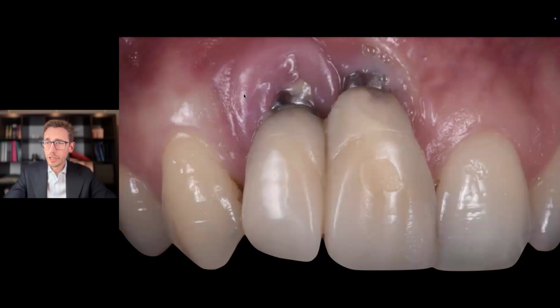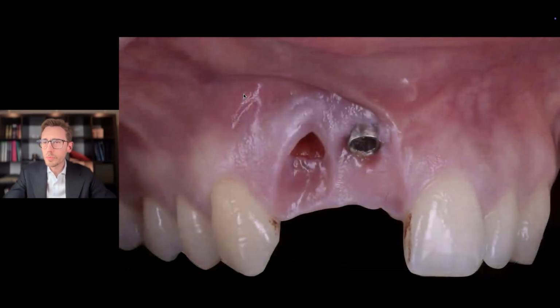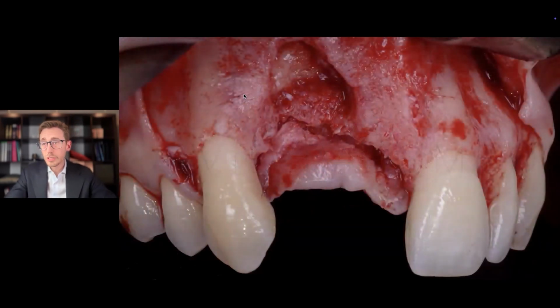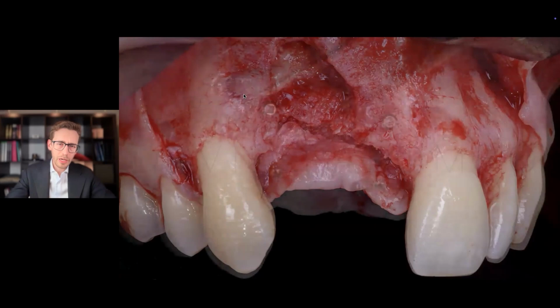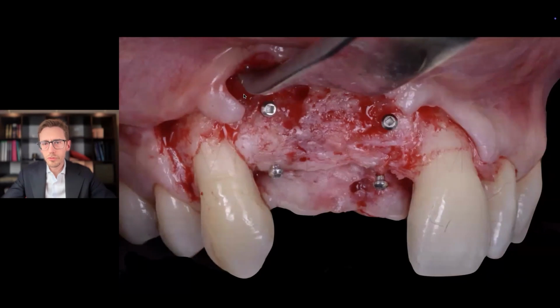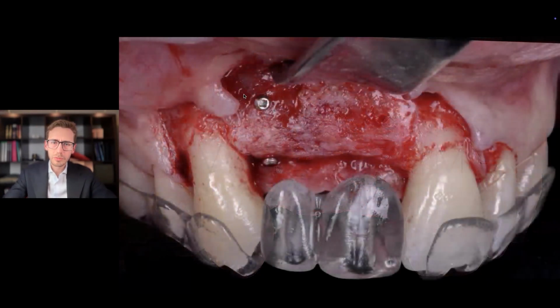This beautiful 30-year-old lady did not understand that accepting a compromise in implant placement and the subsequent prosthetic rehabilitation, without performing a vertical bone augmentation, which was exactly the indicated treatment plan, meant such a huge compromise. Because this treatment in the end led only to a final result. And the final result, of course, is the removal of the previous implant, a novel vertical bone augmentation, which is even more invasive than the one that should have been performed at the beginning of the treatment plan, the reconstruction of a bone architecture that is consistent with the prosthetic treatment plan, and the delivery of a new implant rehabilitation.